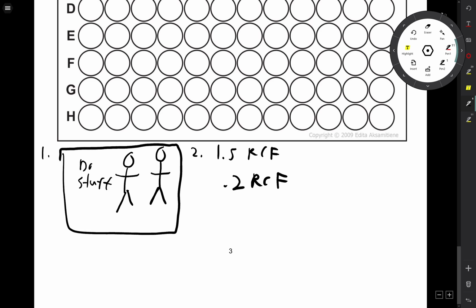A third thing I've noticed is that some people are getting contamination. Make sure that when you're aliquoting in your pen strep and everything else, you are doing it at the proper concentration. It should be 100x, which means you're putting in 500 microliters for your 50 mL conical.